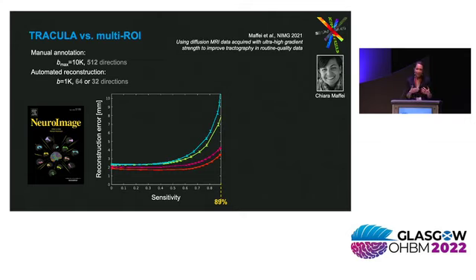However, to achieve that high sensitivity, each reconstruction method has to incur a different level of reconstruction error, which we quantify as the Hausdorff distance between the automatically reconstructed and manually labeled tracts in the same subject. For Tracula, this reconstruction error to achieve the high sensitivity of 89% is a couple of voxels, 3.5 millimeters. And it gets about 20% higher when we use only 32 direction data.